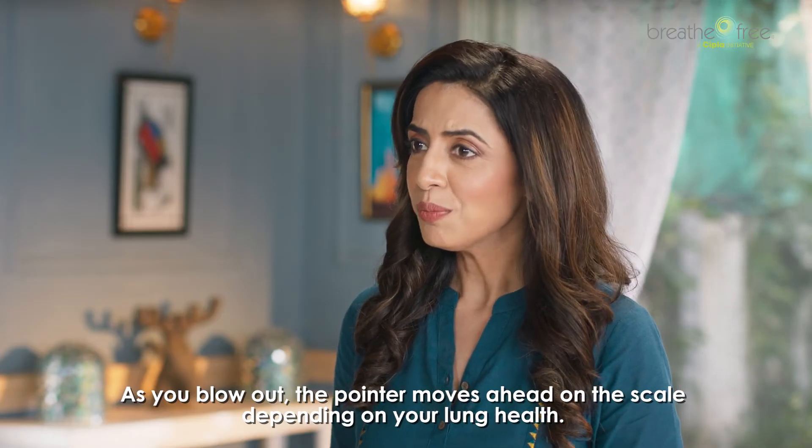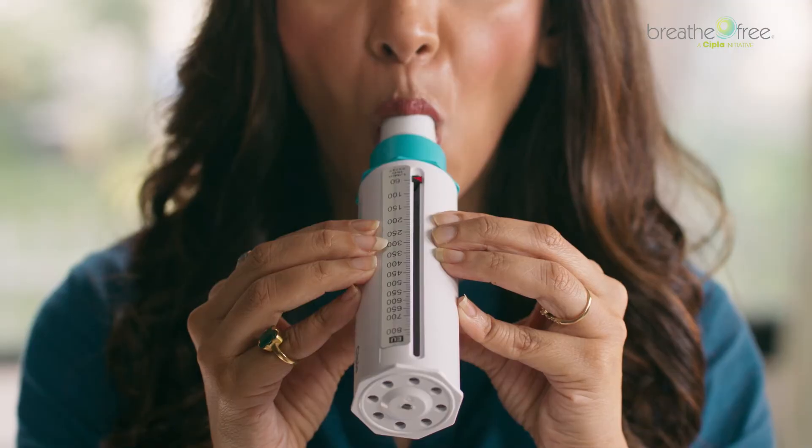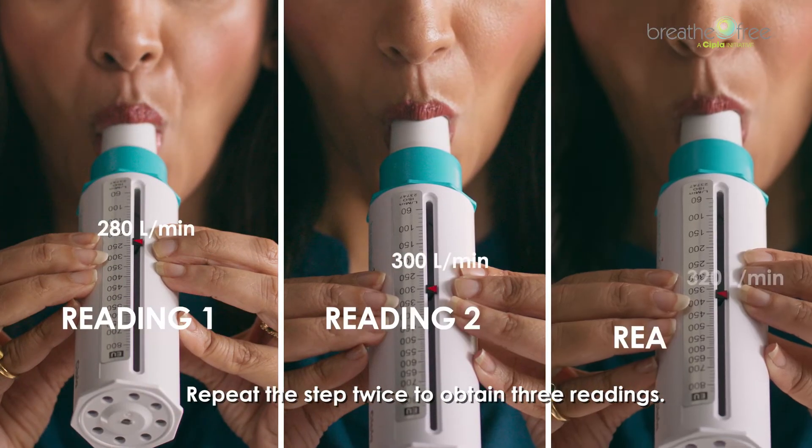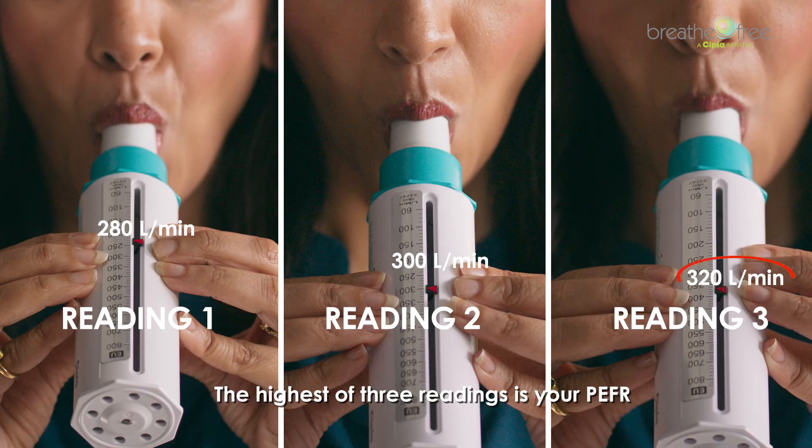As you blow out, the pointer moves ahead on the scale depending on your lung health. Note down your reading. Repeat the step twice to obtain three readings. The highest of the three readings is your PEFR.